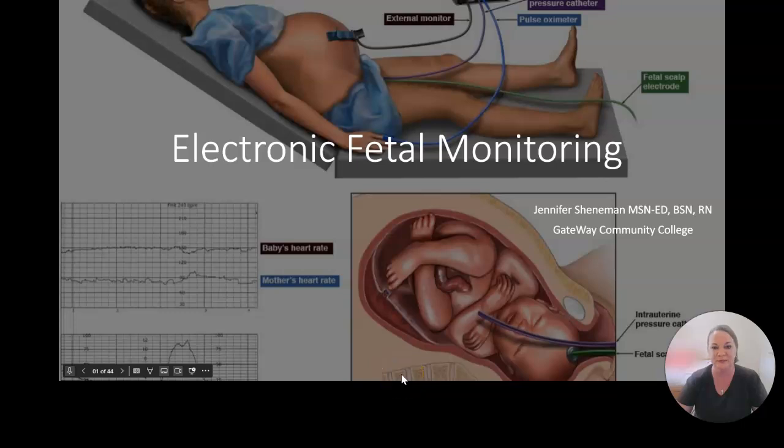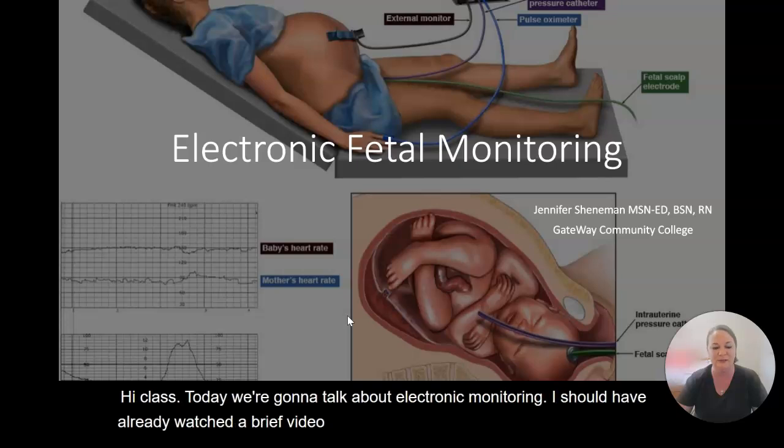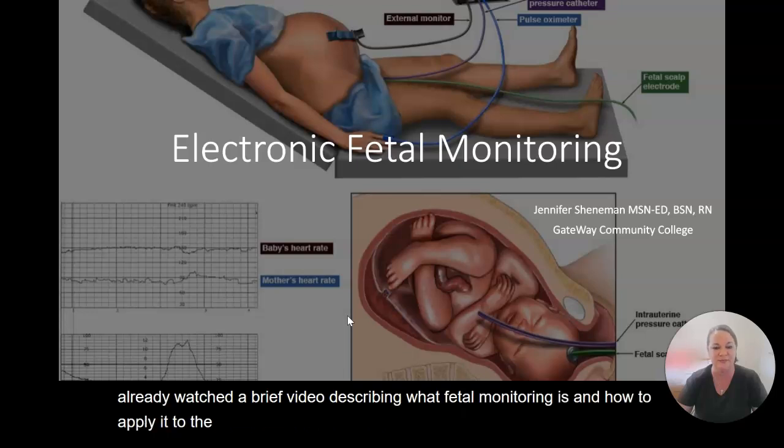Hi class, today we're going to talk about electronic fetal monitoring. You should have already watched a brief video describing what fetal monitoring is and how to apply it to the patient. We're going to dive deep into how to read and interpret an electronic fetal monitor.